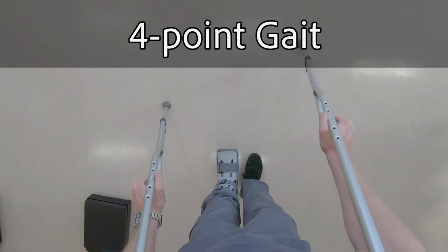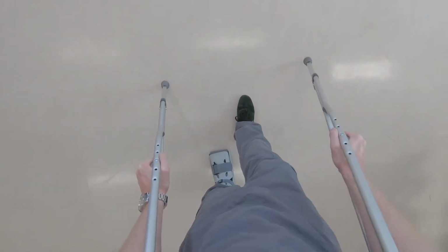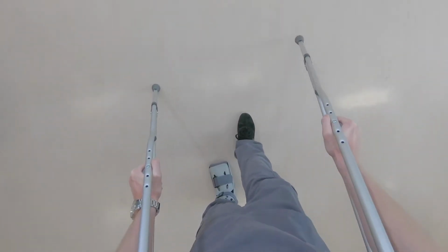With a 4-point gait, advance the right crutch, then left foot, advance left crutch, then right foot, right crutch, left foot, left crutch, right foot, and so forth.